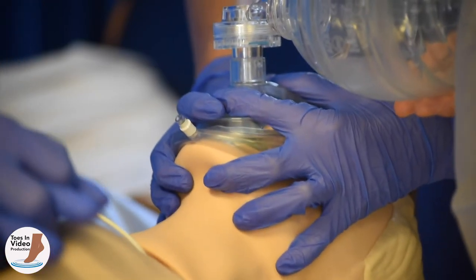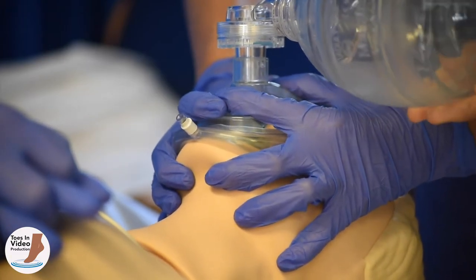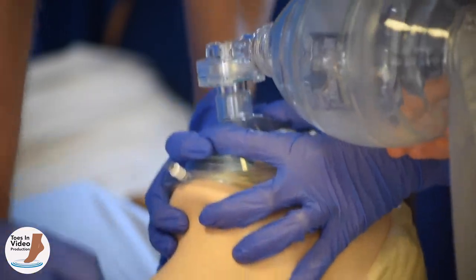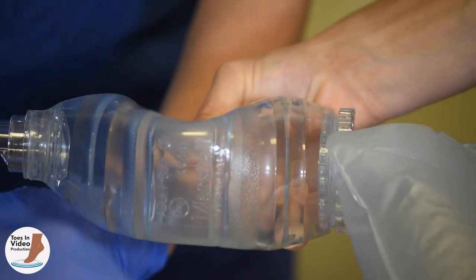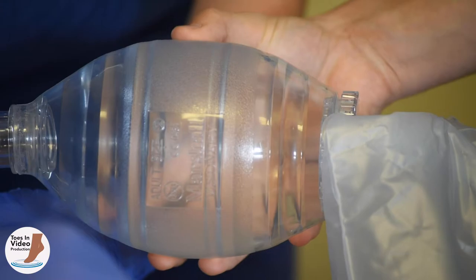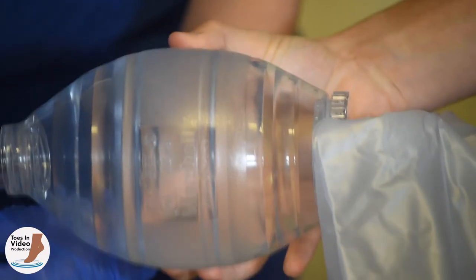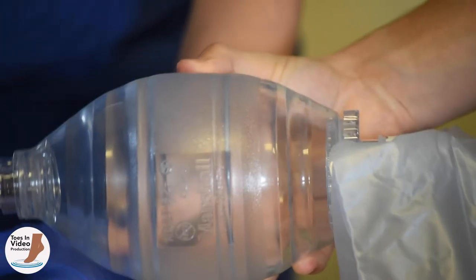Another rescuer then gives two firm ventilations by squeezing the bag. The bag contains 1.5 litres of gas, of which only about 500 to 600 millilitres — approximately a third — needs to be delivered. Squeeze the bag to bring fingertips together through the device and allow it to recoil, then give a second breath. Avoid excessive volumes or short, sharp, aggressive ventilations, as this may cause vomiting or regurgitation, further compromising the airway.